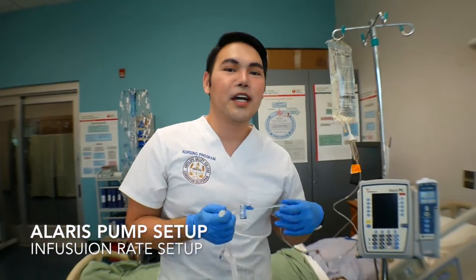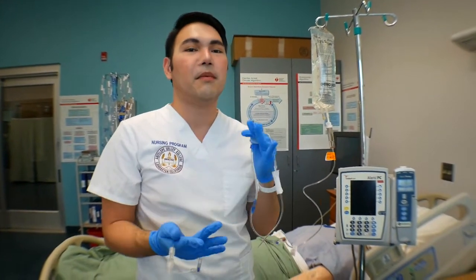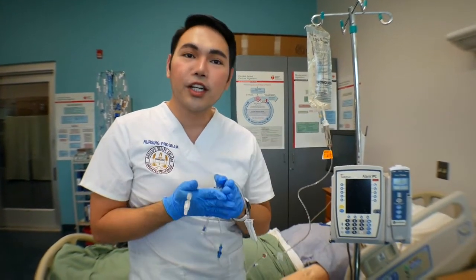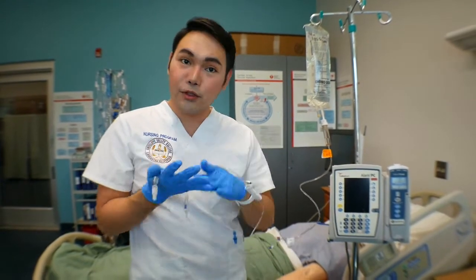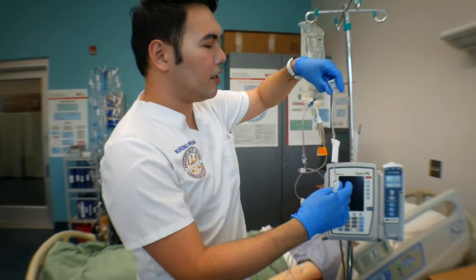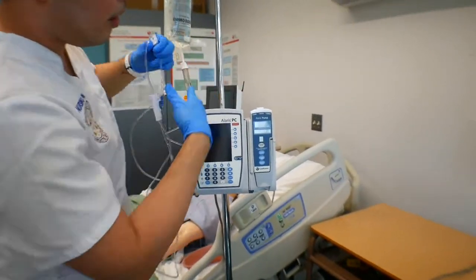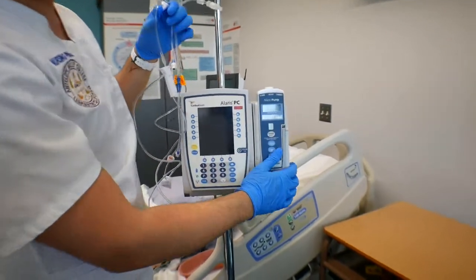Alright, now I'm going to show you how to set up the IV pump. So I've already verified the order, the patient, and the medication, and the infusion. I've already calculated my infusion rate. So just keep that in mind. So now you're going to put the tube in the pump. So we call this the brain and we call this the channel.